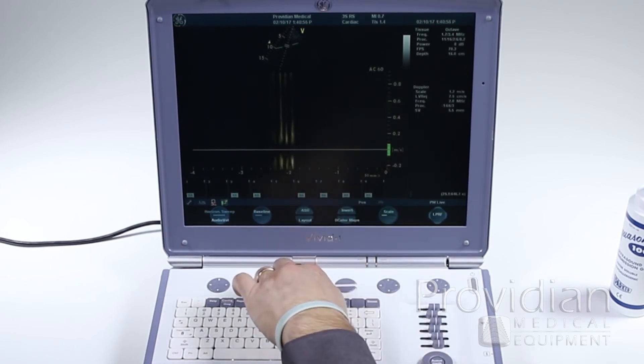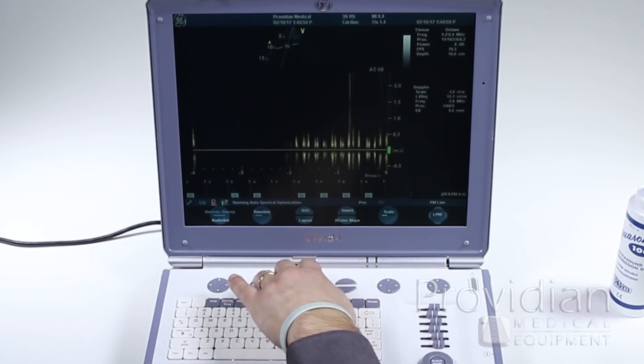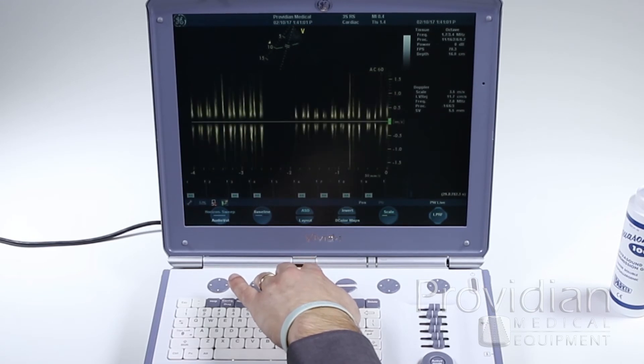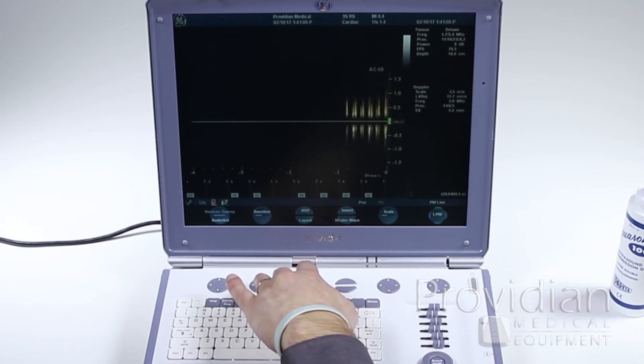So see I change the baseline and the scale, and if I make changes in the image, it's going to react to that. Layout, same as the M-Mode.